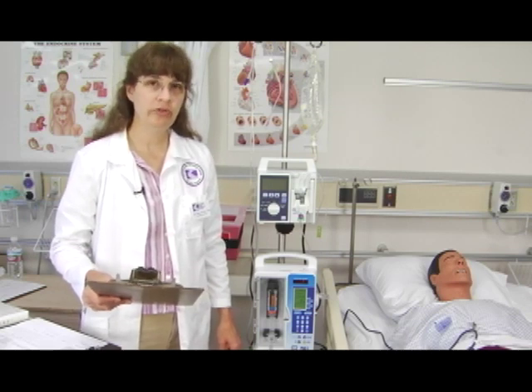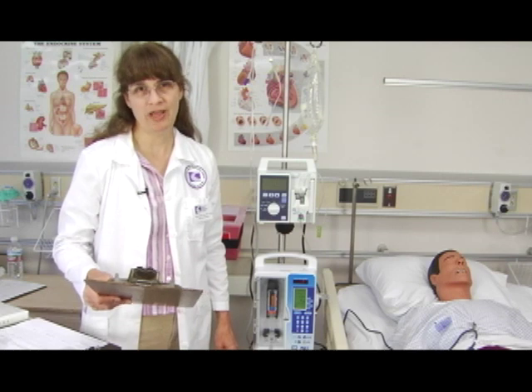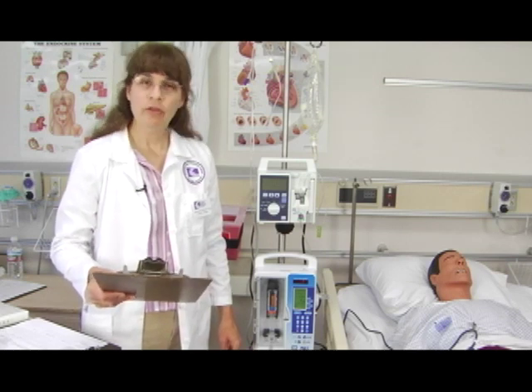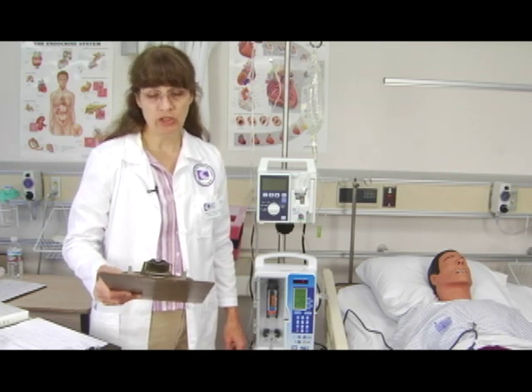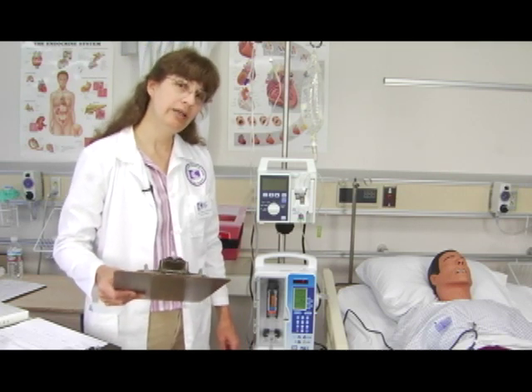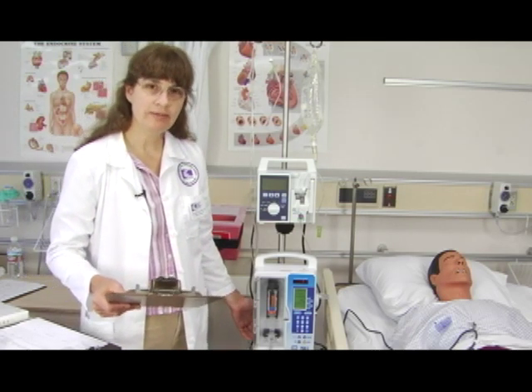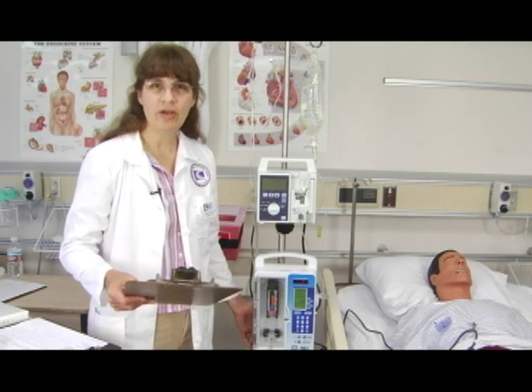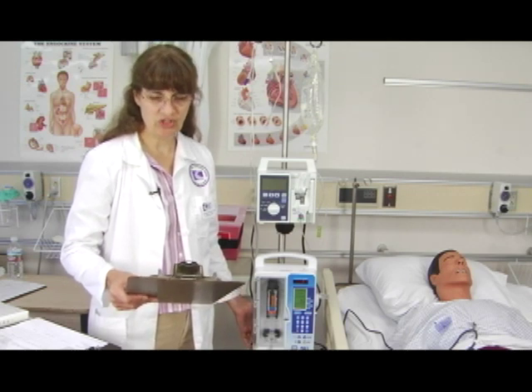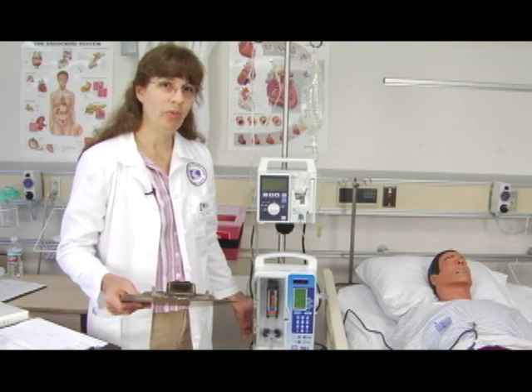You should also have reviewed the protocol for caring for a patient with an IV site. The first portion of the initiation can actually be done in the medication room, or it can be done here at the patient's bedside. Always remember to observe standard precautions, to identify your patient, use the five rights of medication administration, and don't forget to inform your patient about what you're doing.